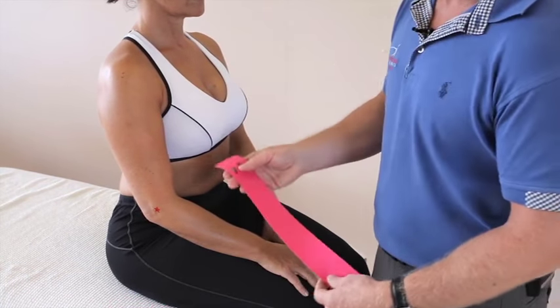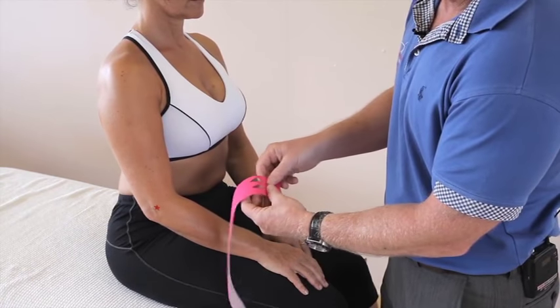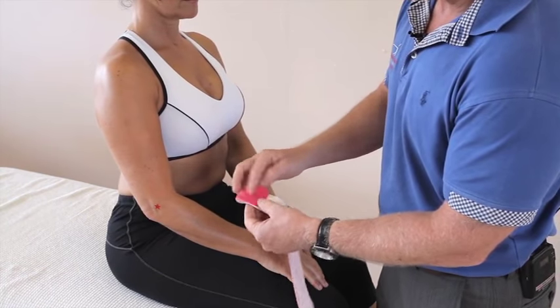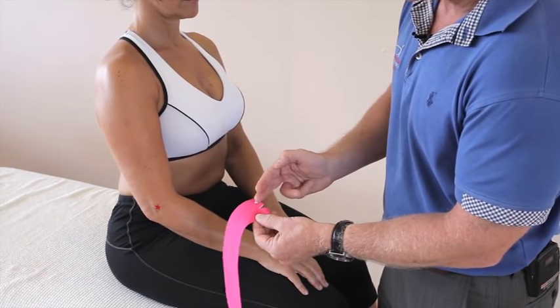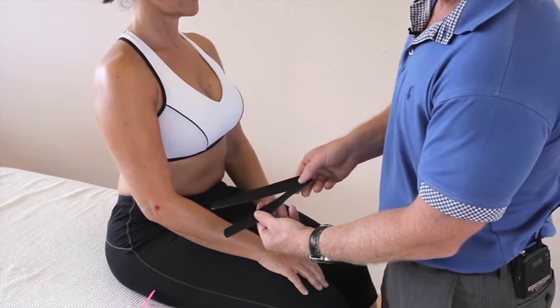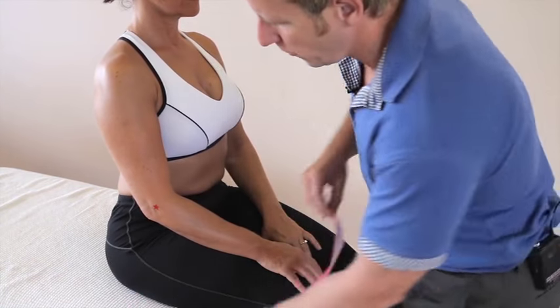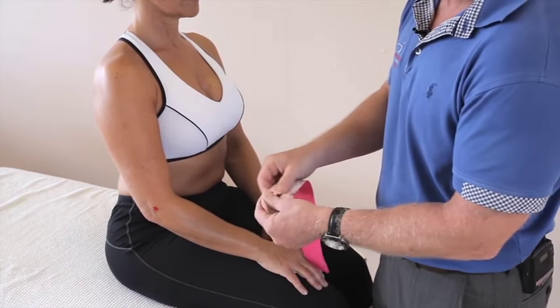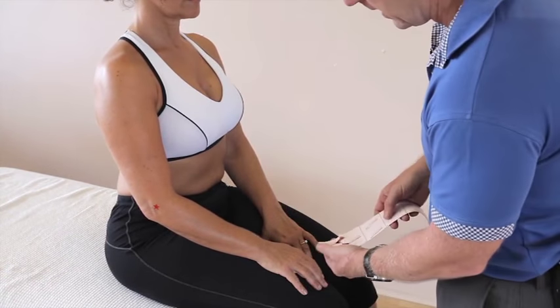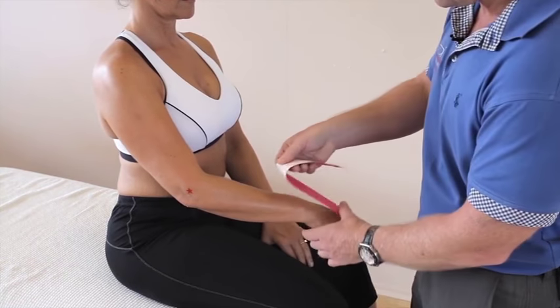One of the pieces I've got is an eye strip and I've actually put in two kites — the shape of two triangles back to back. To do that you fold one square over the other square and literally cut out the shape of those two triangles. The second one is a standard eye strip cut into the shape of a Y, and I pre-rounded the ends. First we're going to split the actual tape, and then these two strips are going to be for the index and the middle finger. As long as the middle finger is included, you'll be fine.